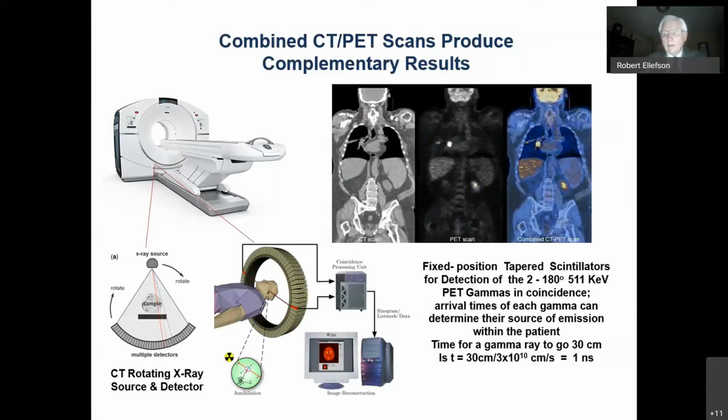From that, you can place the tissue that is generating that at places like shown here, and then they can be superimposed on the CT scan to show that you found cancers located here, near what organ, and how you are going to biopsy that.